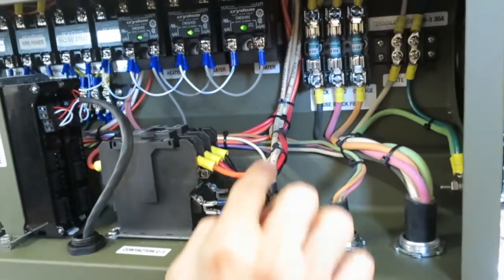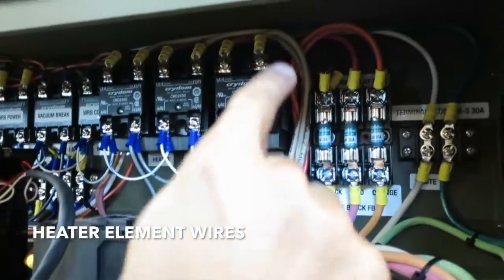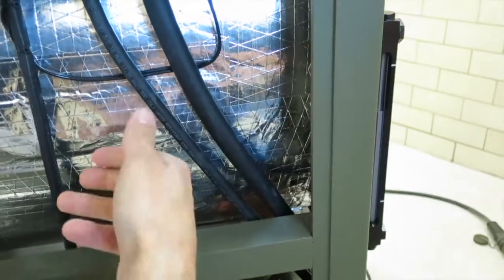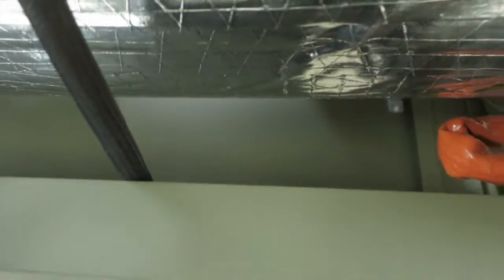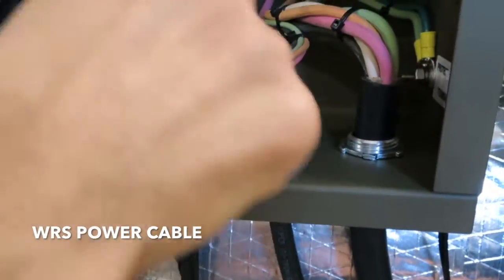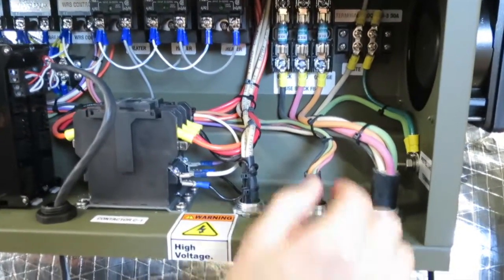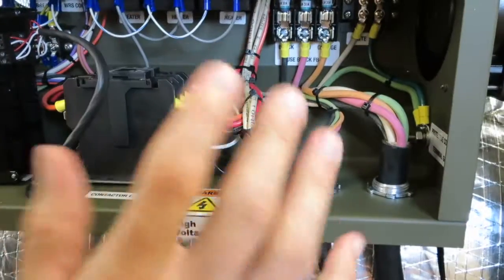Right here, I have the wires to the heater elements. It's these three white wires. If you follow them up, they go to those relays, which we'll talk about in a second. But this goes down to the back to the heater elements, which sit in the jacket to heat up the water and turn it into steam. So those are the wires to the heater elements. Right here, I have a cable that goes down to the water recovery system. You can follow those over. They connect to the terminal boards. This allows the sterilizer main unit to turn on and off the water recovery system. All power for the water recovery system is actually coming from the sterilizer main unit through that cable.